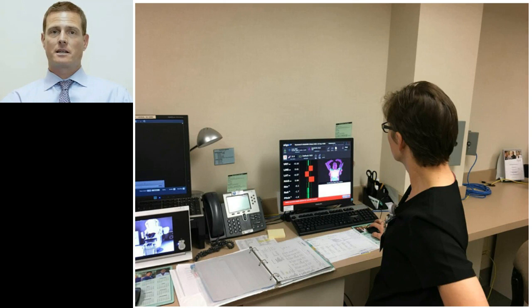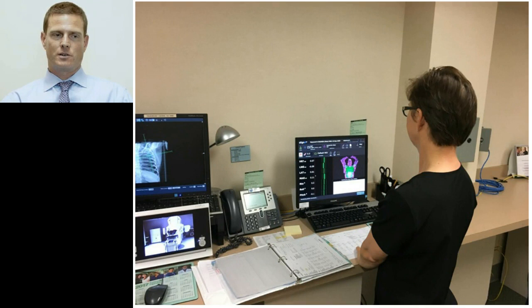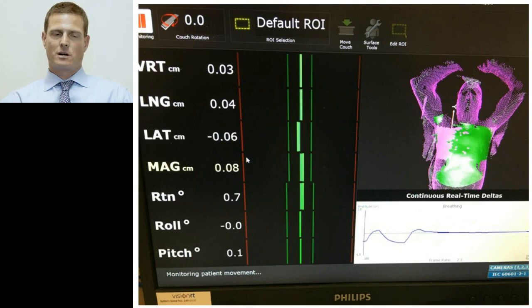Then we allow them to breathe for a minute, 30 seconds, however long until they're comfortable, and then you see Teresa outside here looking at the console, and the patient is out of tolerance now because he's free breathing. She says, take a deep breath in, blow it out, take a deep breath in, and hold it, and then there you see, she's happy because he's got all greens there, he's locked it in. That's just zoomed in here to show how he really did quite a good job of a reproducible breath hold.